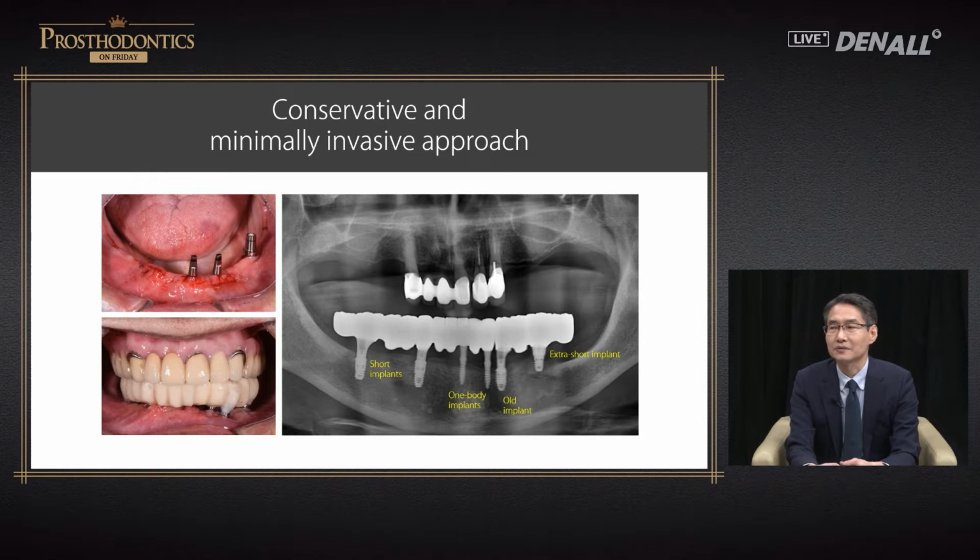There's just normal implant, 8mm and 7mm short implant. In the posterior area, where mandibular nerve is close, 4mm implant was placed and full arch restoration was provided. This patient was an older patient and it was difficult to do advanced surgery, so minimally invasive surgery was done. Same-day restoration was provided.